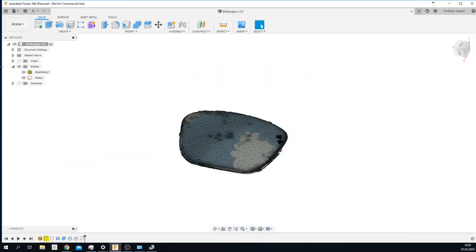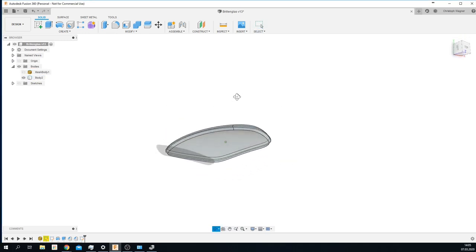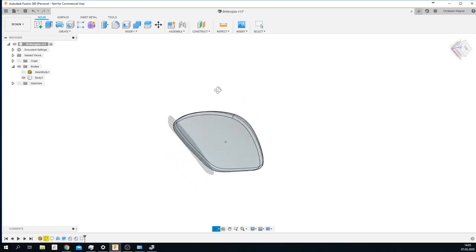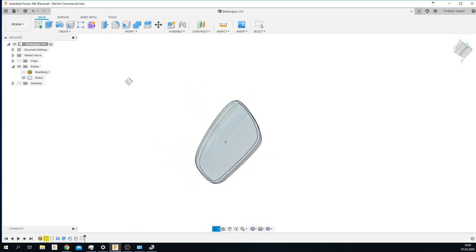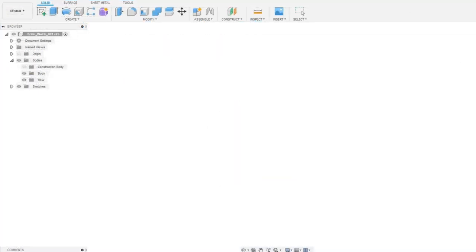I was fortunate enough to get my hands on a 3D scanner which I used to get my lenses scanned. So I had a pretty good starting point for the design.